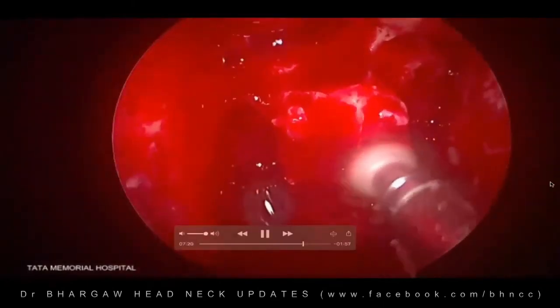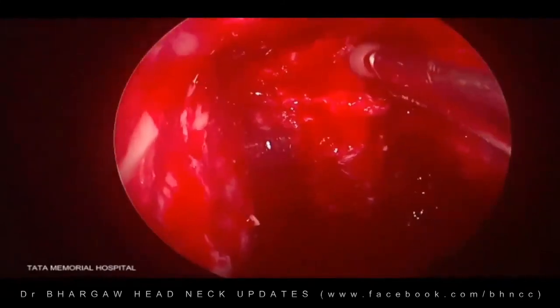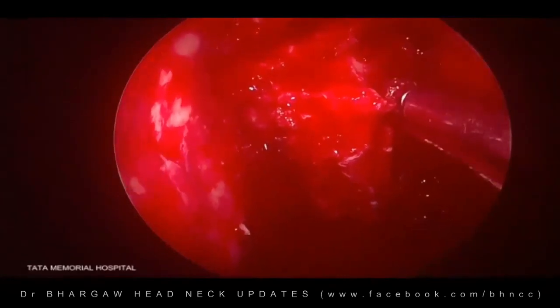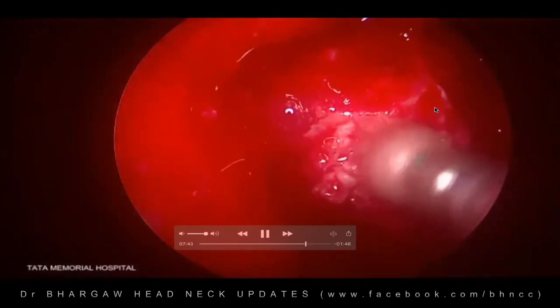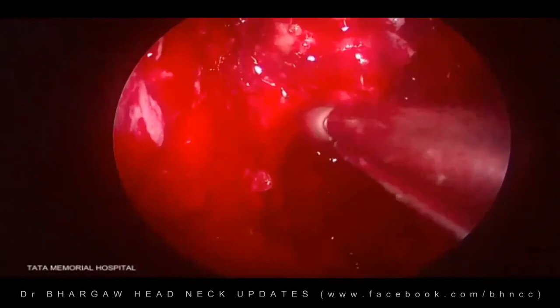So you just have to drill this bit till you thin out the bone as much as possible. This has to be drilled adequately well, and then the crista galli also has to be removed properly. Otherwise, reconstructing it will be a problem.